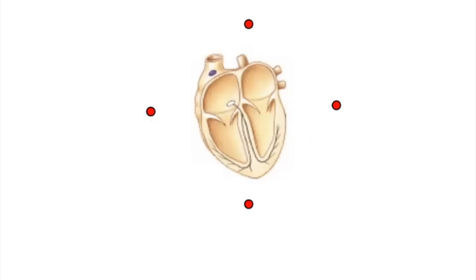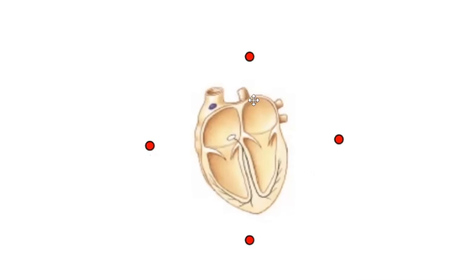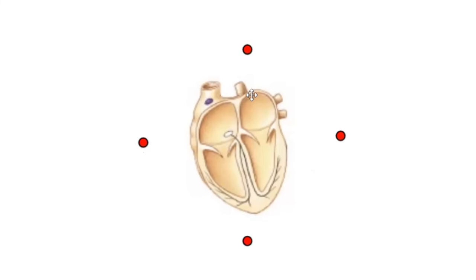Okay, so we have 4 electrodes here. How do we want to hook them up? What do we want to be positive? What do we want to be negative? This is the choice. We get to make this choice. Stick with conventions and do the top and the right are positive, and bottom and the left are negative. Okay. So positive, positive, negative, negative. Is that what you're saying?